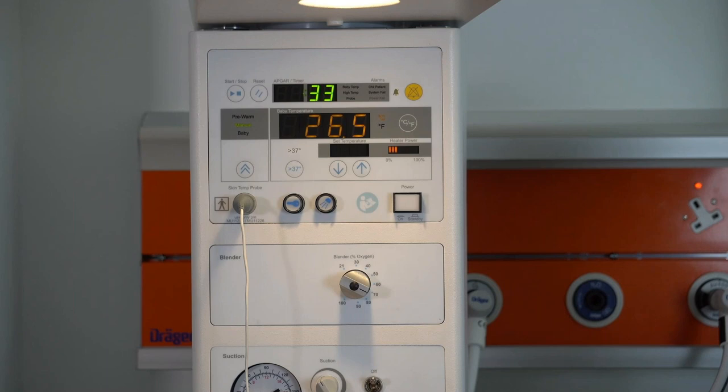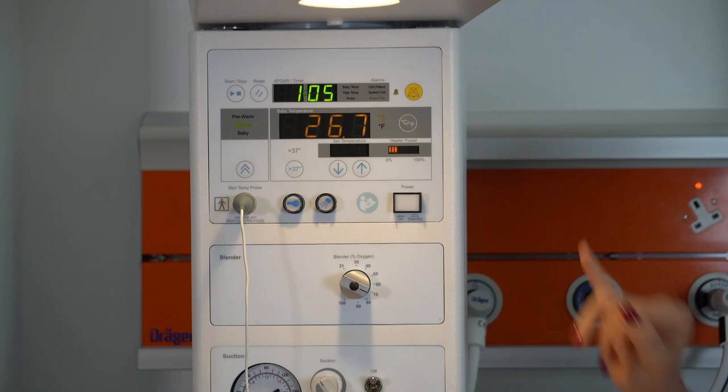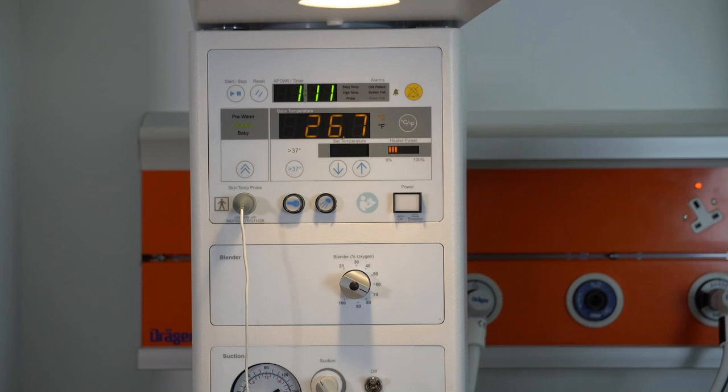And you can always have the information how much time has passed since the resuscitation started, and it's easier to make notes. And I think Linda highlighted a few times that it is absolutely essential that you take notes of all of your interventions. And then you take the notes and support them with any documentation that you're providing post-resuscitation. Here's your first minute timer. We're trying to make this workflow as easy as possible, so you always have the information on how much time has passed since the beginning of resuscitation.